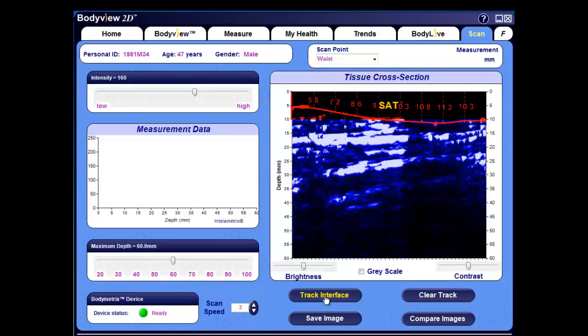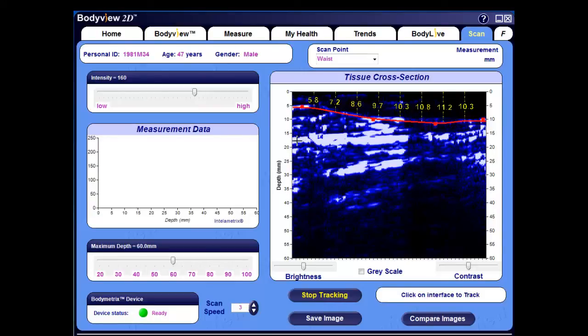We have now quantified the superficial adipose tissue layer from the top of the image to the fascia. Next, let's track the actual fat muscle interface signal here at 17 millimeters and adjust it as needed. We'll click the Track Interface button first, and go directly to that second band, and then click. Again, when you're satisfied with the tracking, click the Stop Tracking button. The layer between the two red tracking markers represents deep adipose tissue, or DAT.